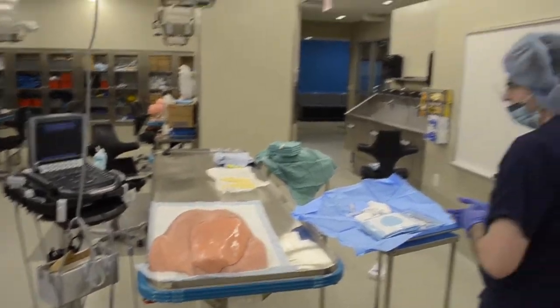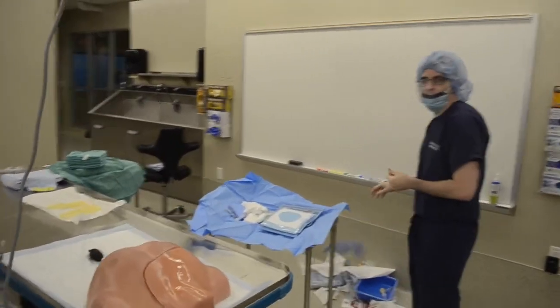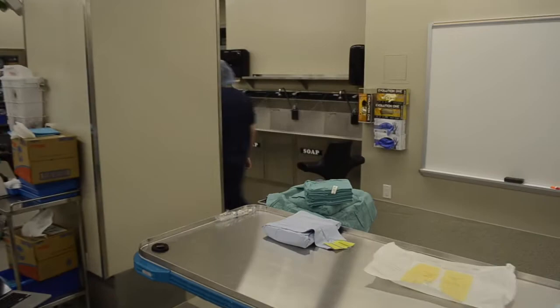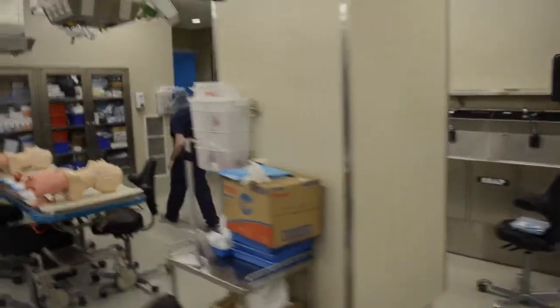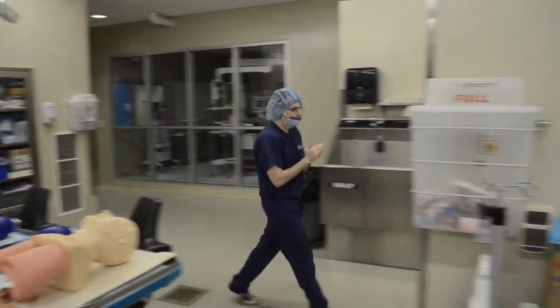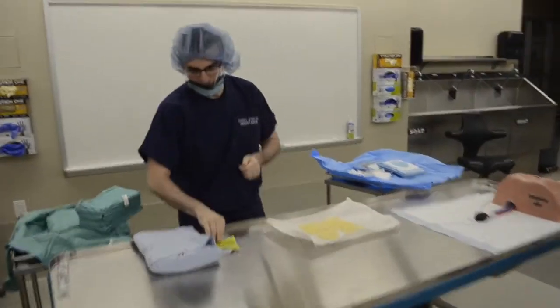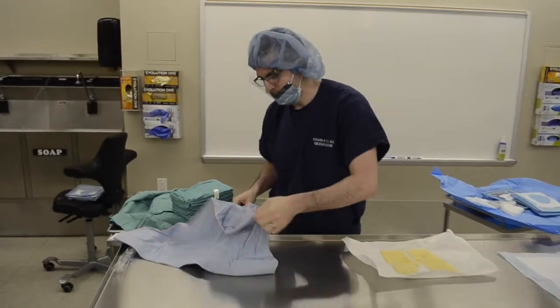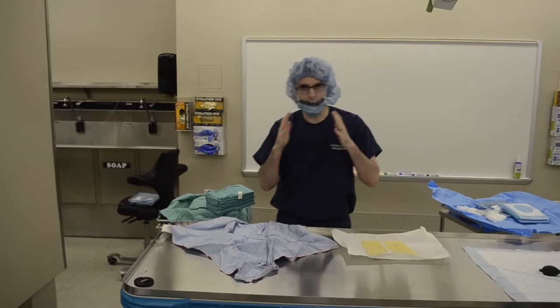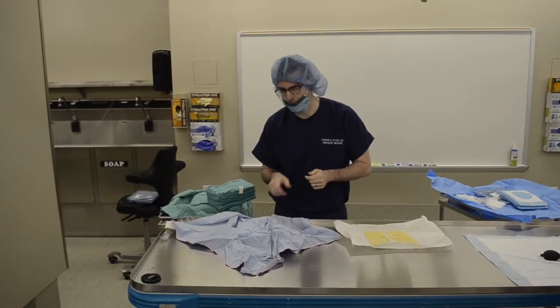Alright, now that the patient's cleaned off, it's my turn. So we gotta make sure that we wash our hands first. Just go ahead and put on some hand sanitizer. Now we're ready to gown ourselves. So ideally you want to be able to do all of this with no assistant, all by yourself, which sometimes is necessary in an emergency.